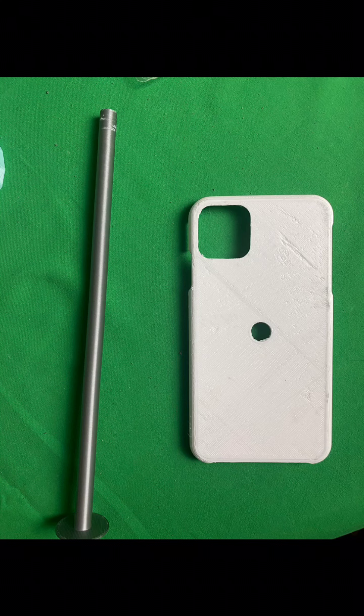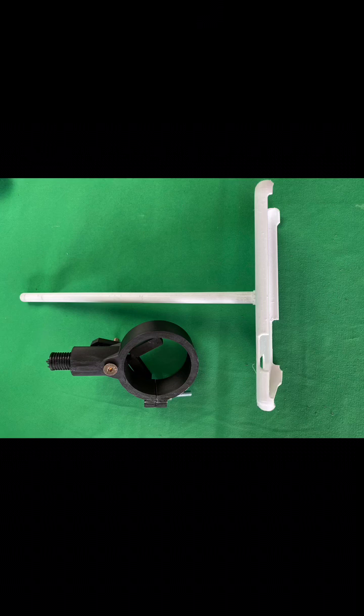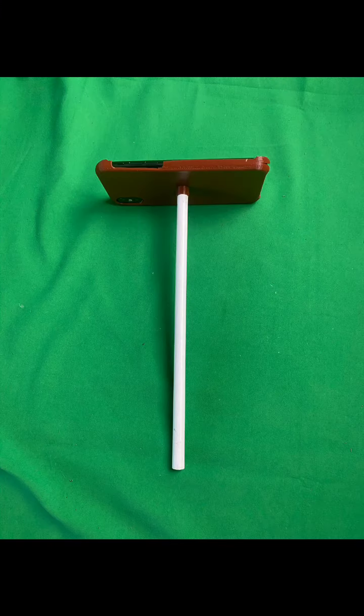The unsterilized iPhone should be placed in a sterilized waterproof sealable bag. The surgeon should place the iPhone in the case place of the case iPhone probe tool, CIPT, which is previously sterilized according to manufacturer guidelines for the 3D printed material specification.